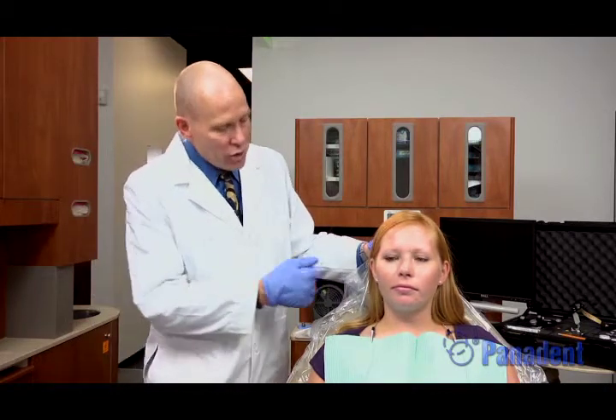Hello and welcome to my demonstration of a true hinge axis transfer and mounting procedures. We've already recorded the patient and marked the scan of her true hinge axis, so we're going to do a true hinge axis transfer at this time.